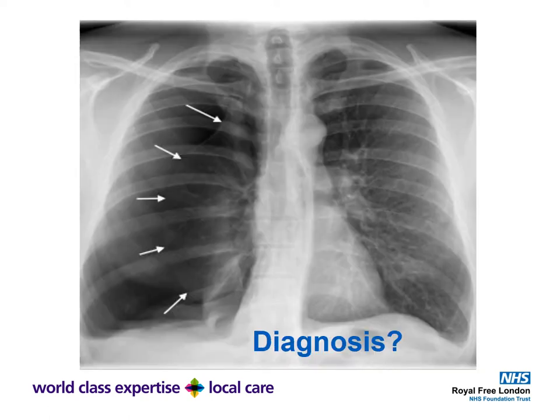What's the diagnosis here? There is a large right-sided pneumothorax, as evidenced by the arrows. Looking at the highlighted area, there is probably a difference of about four centimeters between the rib cage and where the lung tissue has collapsed to. This is the type of patient where, rather than a simple aspiration, we would go ahead and insert a chest drain.